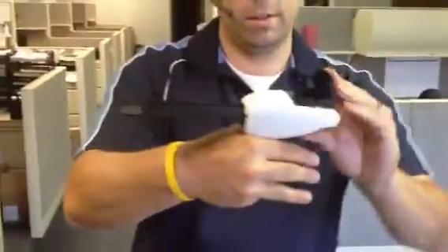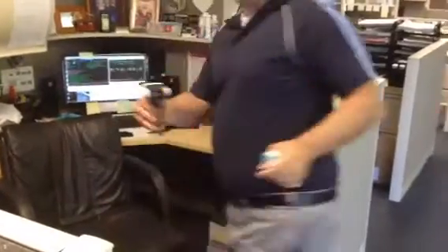Then you can hold that down and pull it all the way back. Pressure control cartridge — pop it up, slide it in. Ready to go.